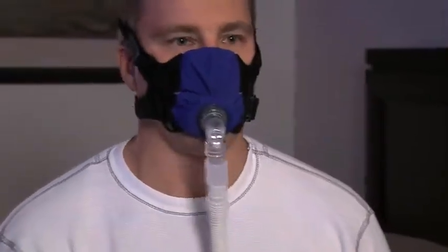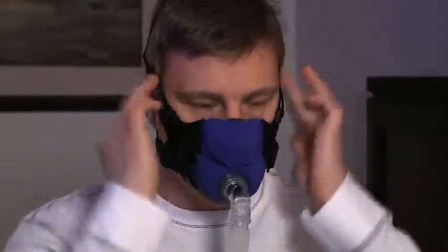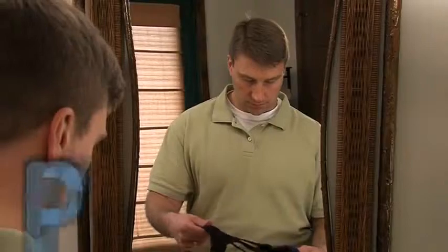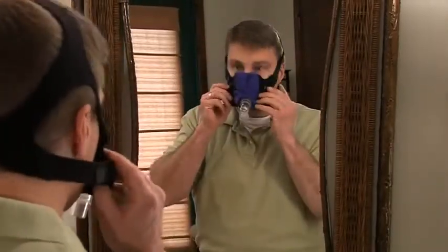If you are experiencing leaks with your mask, please try the following techniques. First, wiggle the mask into place by shifting the mask left to right and up and down while gently pushing your nose into the nasal interface opening. Next, adjust the straps as necessary to achieve a comfortable seal.